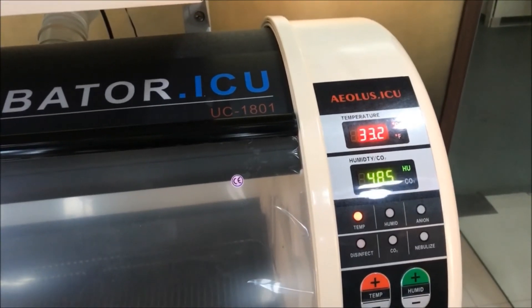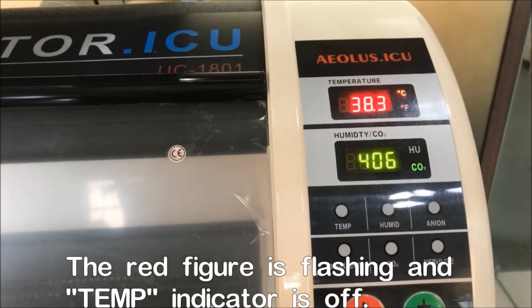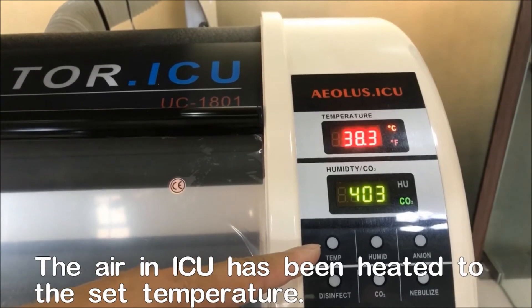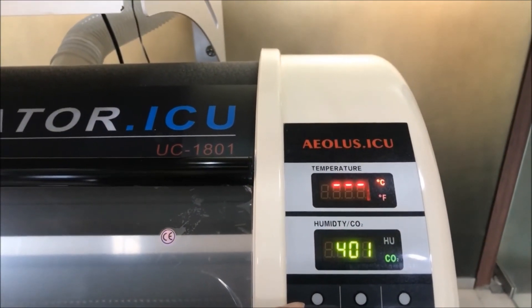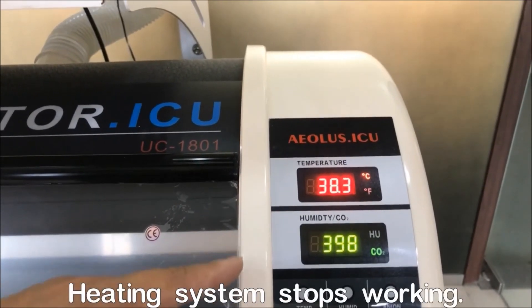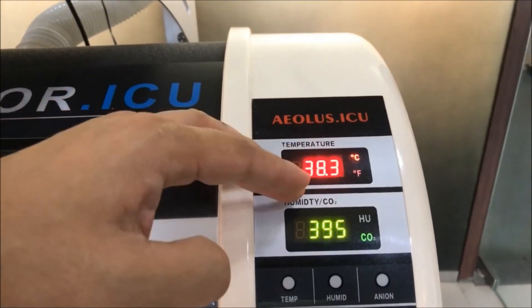At this moment, the temperature light is off, showing you it is no longer heating. The temperature has now reached the desired level at 38 Celsius degrees, so the whole machine has stopped heating and is holding at 38 degrees.